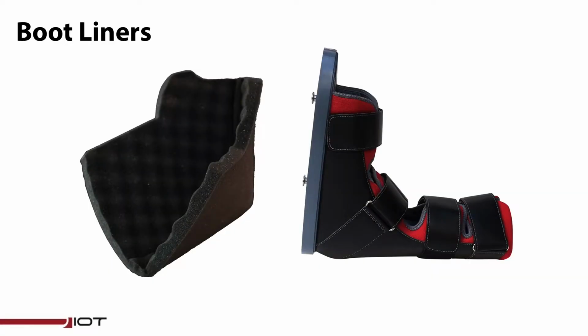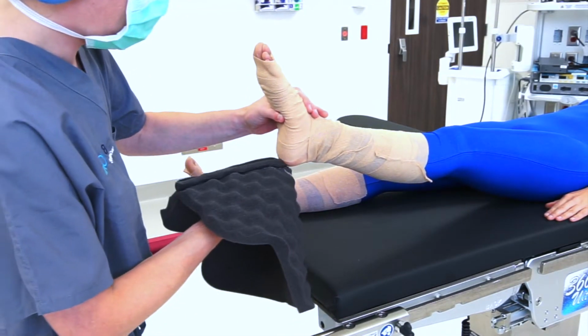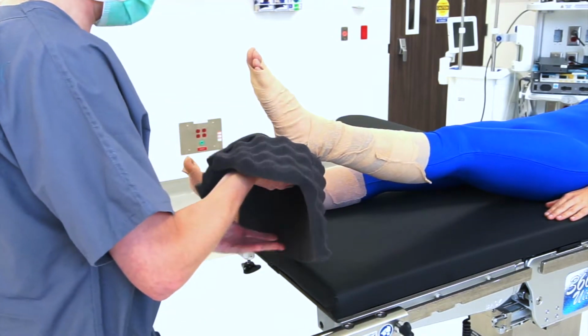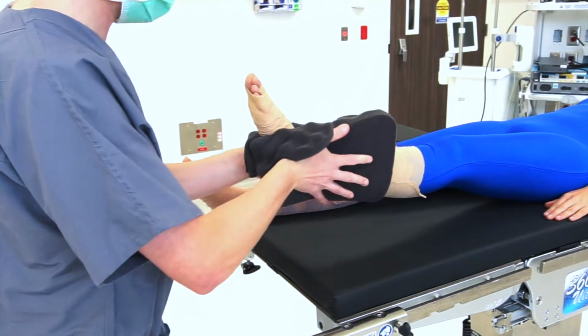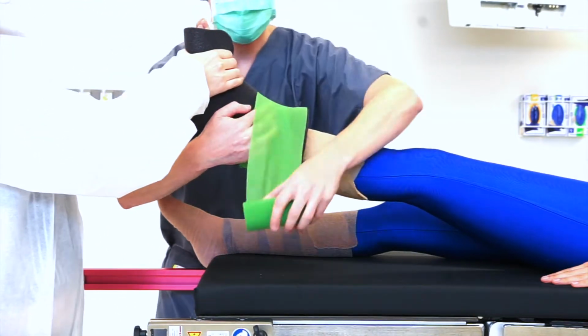Next, put boot liners on the patient's feet. These create a more secure traction boot fit and can reduce the risk of pressure points from the traction boots. Flip the boot liner inside out and roll it over and around the foot. This will help ensure the heel is fully seated in the liner. Roll the excess foam over itself and hold the liner in place.